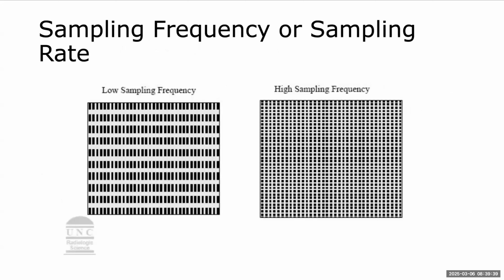This is just another picture. You can get an idea of lower sampling frequencies compared to higher and how it changes the size of the pixel.